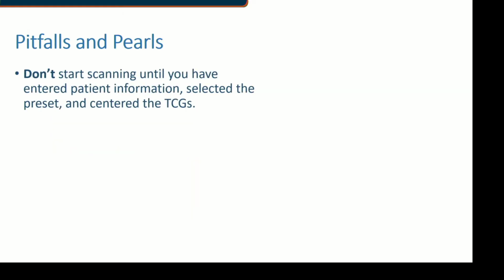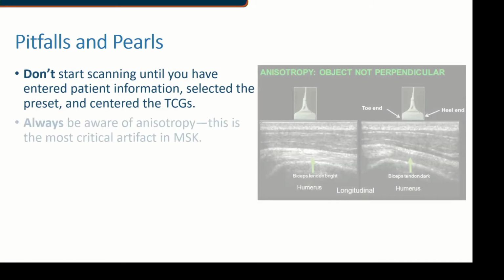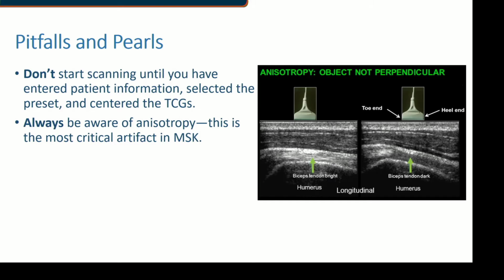Okay, some pearls and pitfalls. Remember again, don't start scanning until you have put in your patient information and selected your preset. Preferably set your preset for MSK if available, otherwise you can use superficial. Always be aware of anisotropy. This is really the most critical part of artifact in MSK.